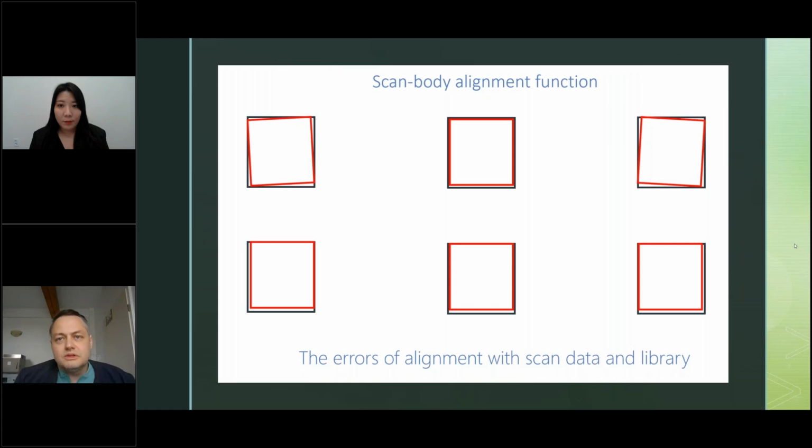So if this still happens and you have sent such a scan, it would be interesting not to numb the patient when you go down with your crown. If he feels a little pain that goes away after you stop screwing, you've probably only compressed the gingiva. But if the pain persists after you tighten the screw, then you probably have pressed the bone and you're going to have bone resorption. So please, if you are able to, always take impressions of the emergence profile.